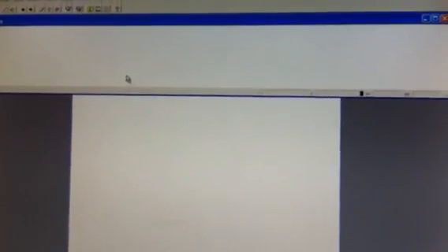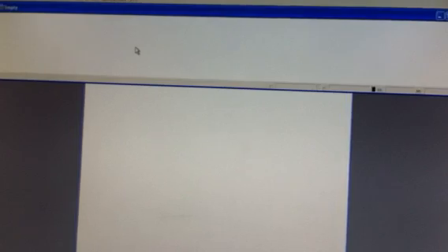Here you see two screens, an upper screen and a lower screen. It's the upper screen that you collect your data on. This is the screen where you ask the patient to sustain a vowel at a comfortable pitch and comfortable loudness.